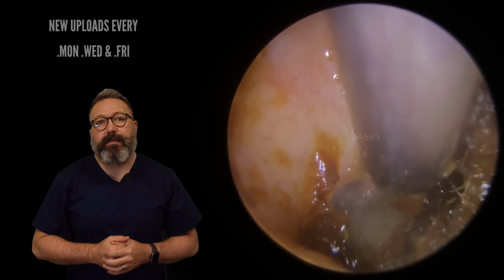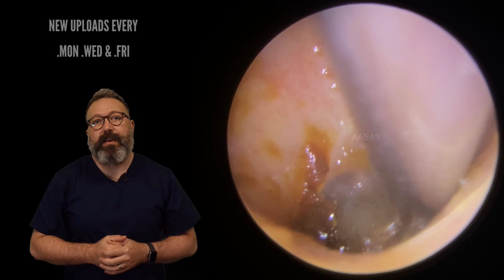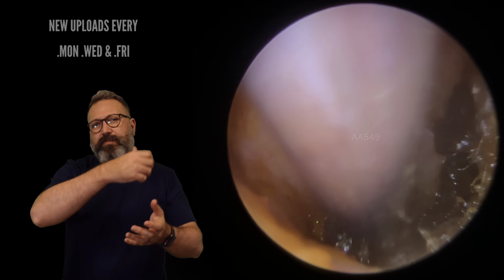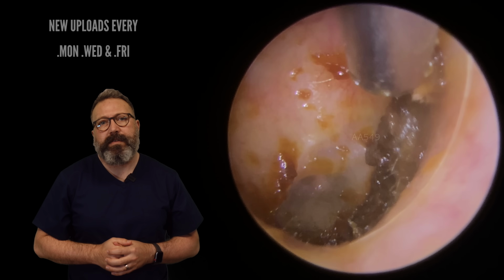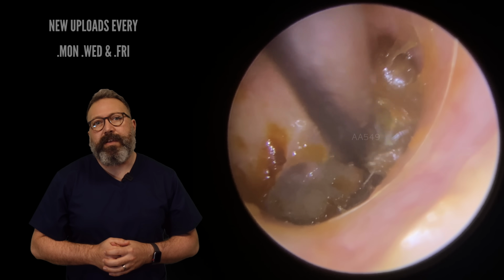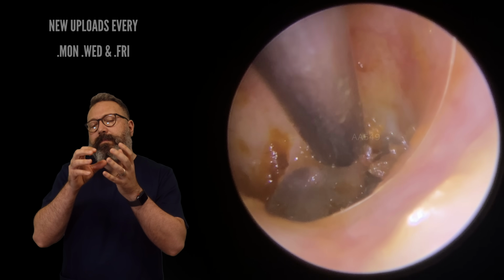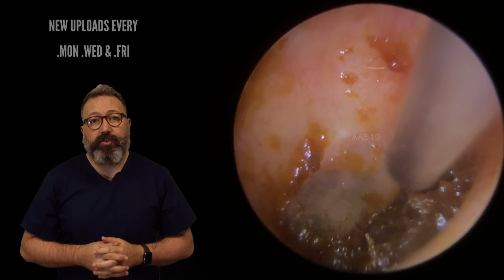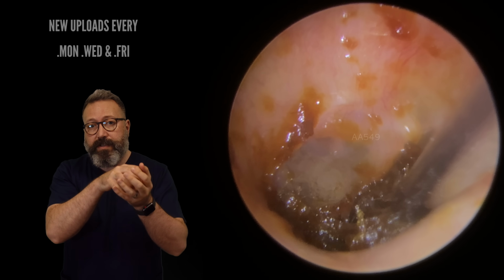There we are. See how it's all starting to kind of implode down a little bit, but we've still got this big scooped section here. Let's get rid of that piece. As we pull down from the top, what I'm doing is, because there's not quite enough room on the surface of the wax to drop the suction tube straight onto it, I used the top section and pulled that down first, and that created a bigger surface area to hold onto.